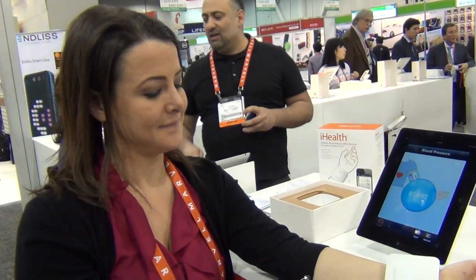Hey everybody, it's Cheryl Lawson. We're live here at the 2013 Consumer Electronics Show looking at the iHealth booth, and we're here with Sarah. Hey Sarah, tell us what iHealth is.